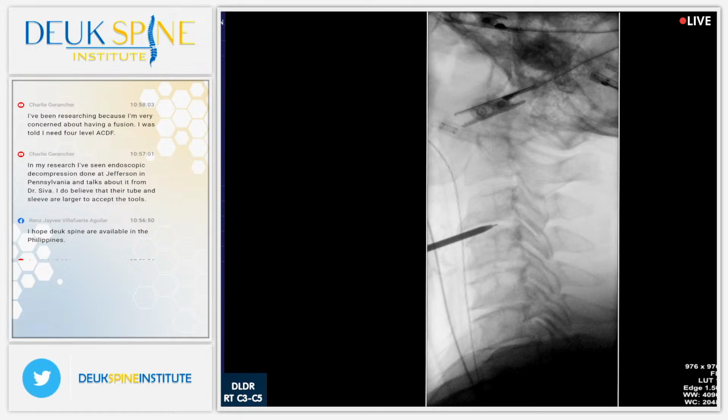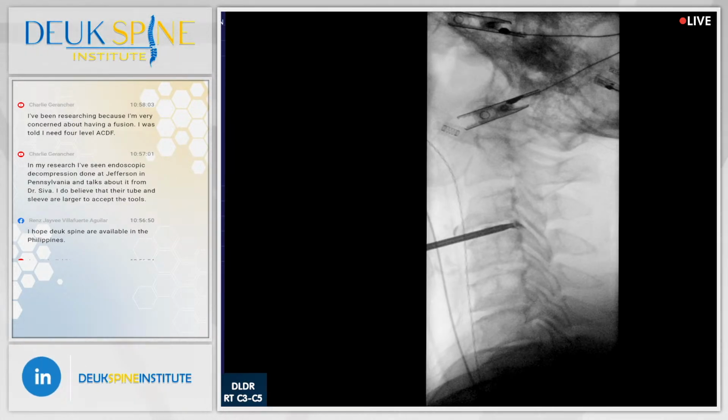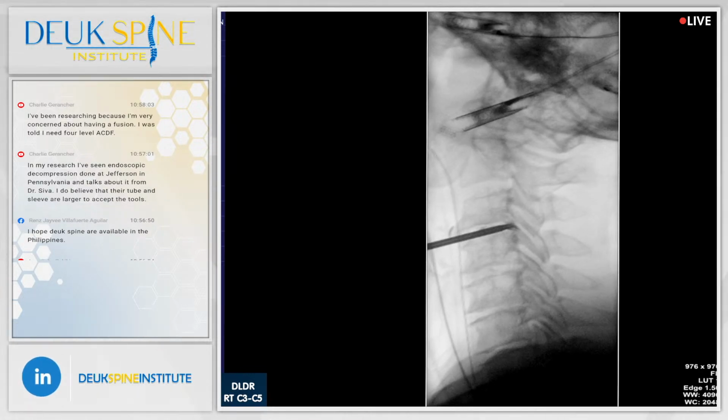There's no room for error or carelessness in this type of surgery. All right, discogram. Perfect. See the tear back there? Show us the tear, Jordan. That's the tear we're going to go fix right there. Yep. And we use a laser to do that. There is no tool in the world that works better than the laser. Not even close.